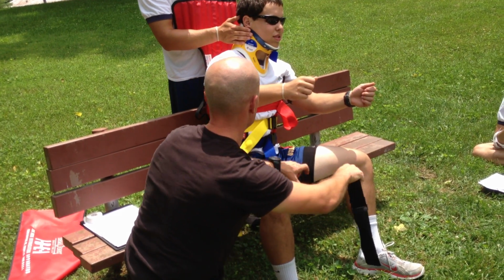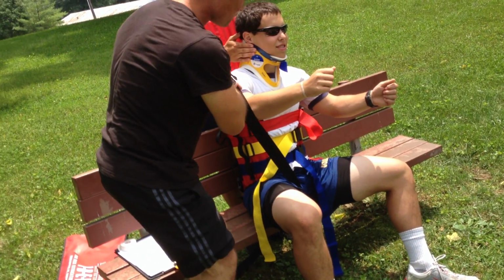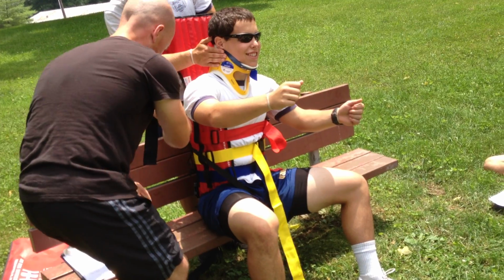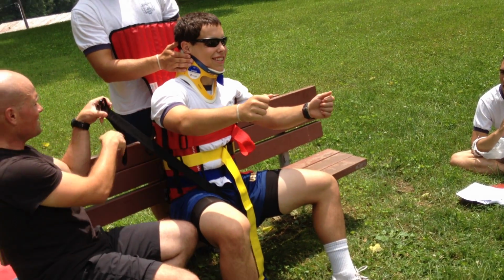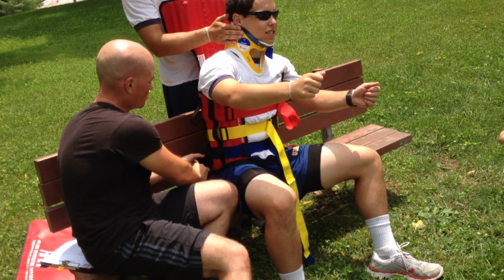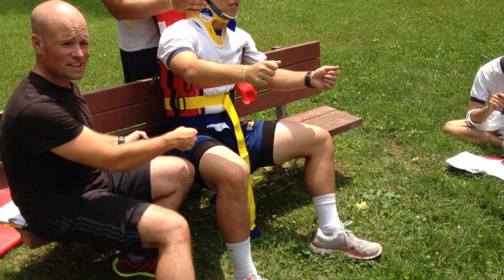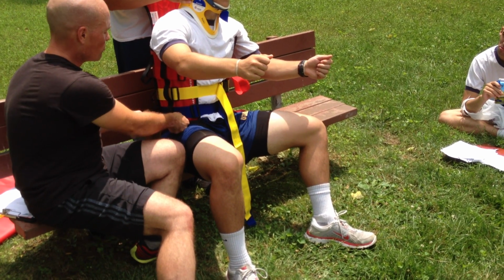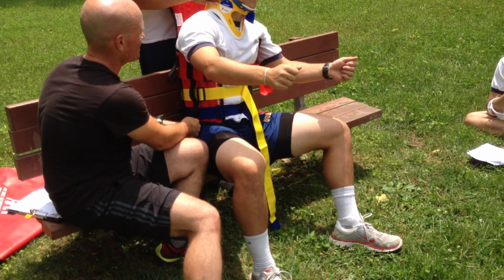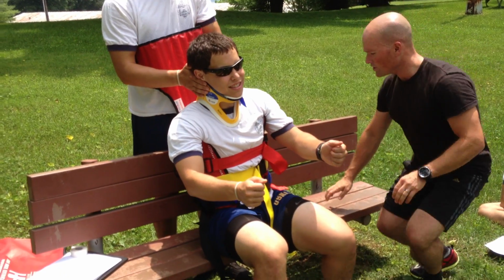So pull the tension, bring that uncomfortably close to the family jewels, or whatever the equivalent is on a female patient. I don't know the name for that. Tighten down that a little bit and then buckle it in the appropriate buckle. And again, he's really not going to appreciate it if I yank on this strap, so push and pull at the same time to get the desired level of tightness. Is that okay? All right, let's do the same thing over here on the left.